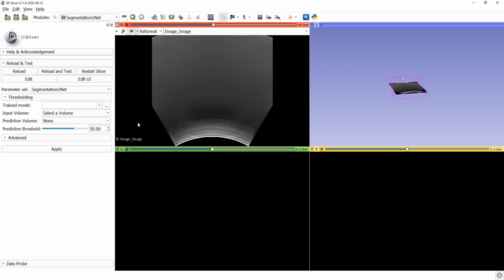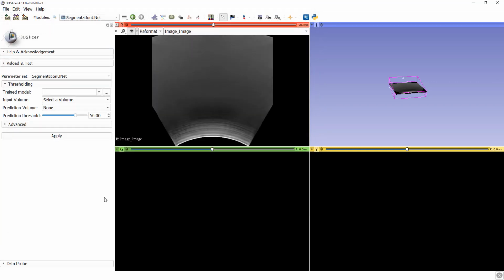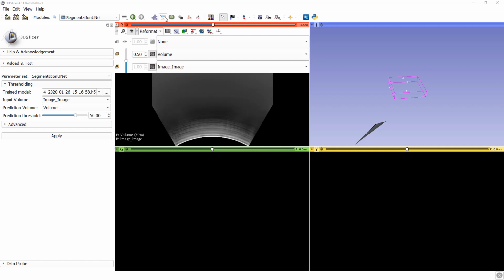Now that we have done this, we have a simple Slicer module that uses a UNet, an already trained UNet, to segment the images in real time. So we have loaded this trained model. Now we select the input image. We create an output image, which is going to be the prediction of where bones are in the ultrasound image.